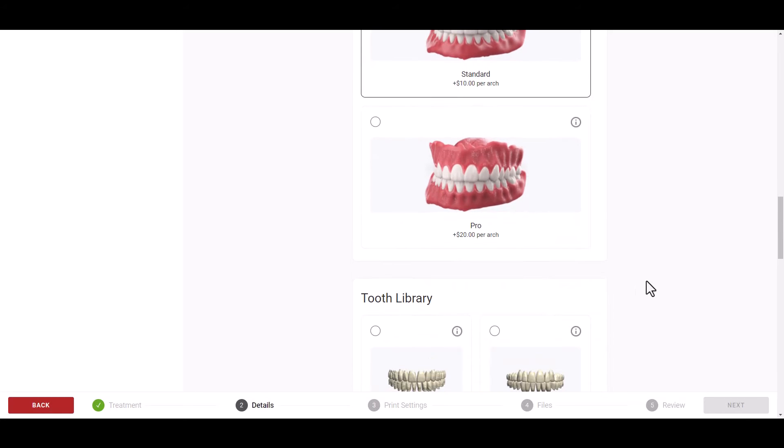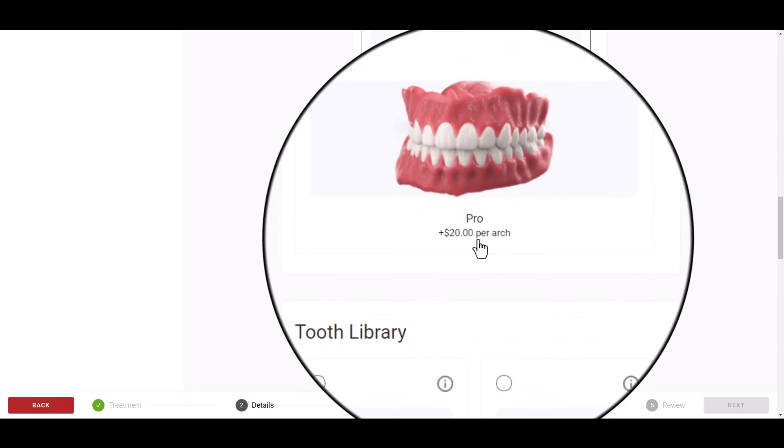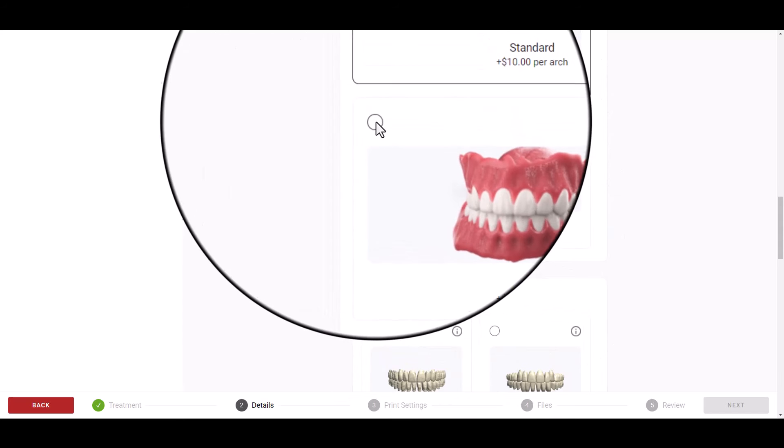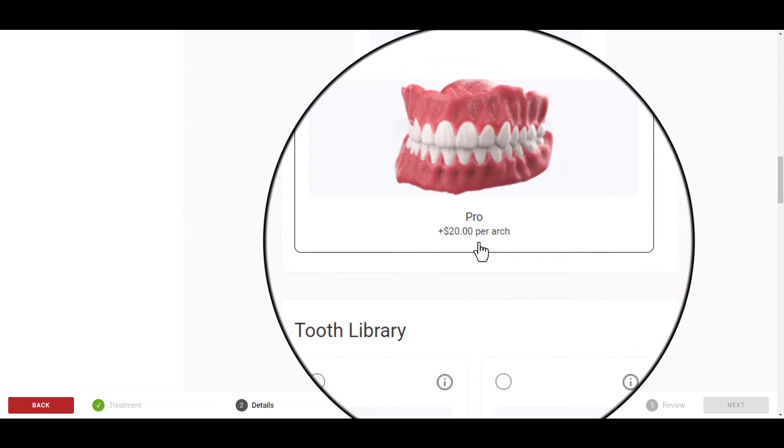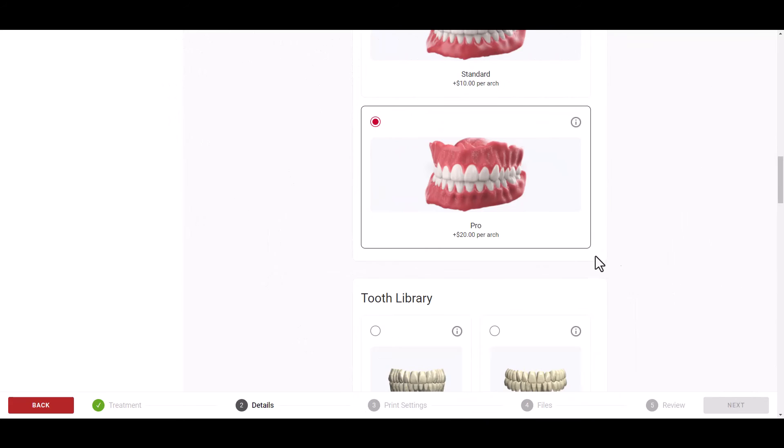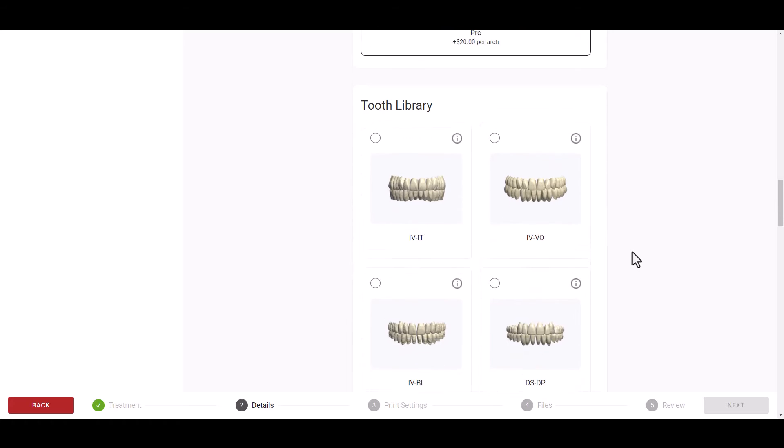Once the Pro Denture Design style is selected, scrolling down will reveal the seven different tooth library options available.